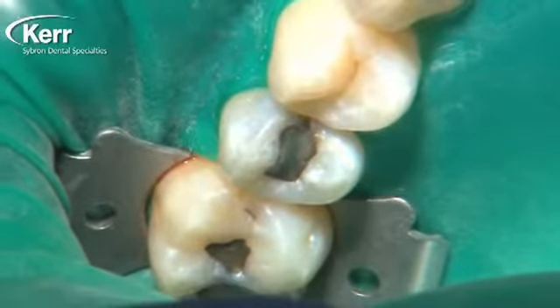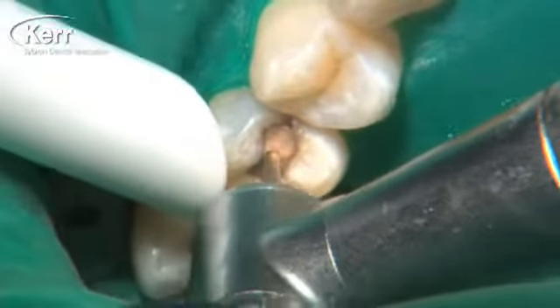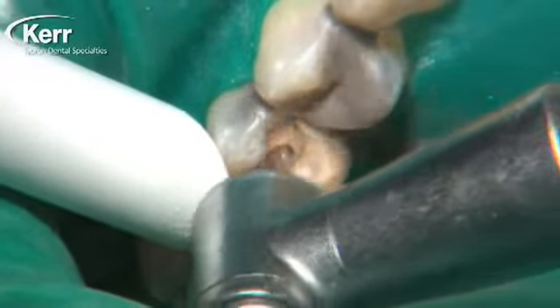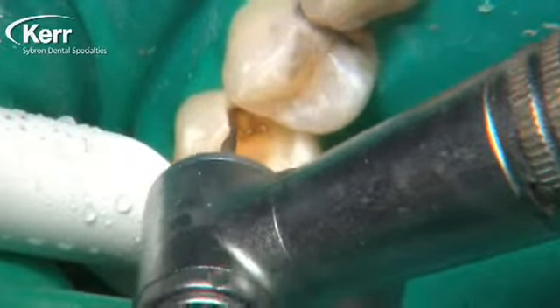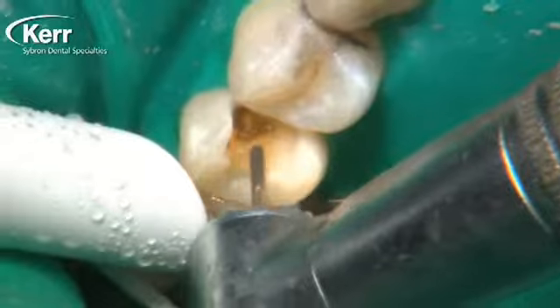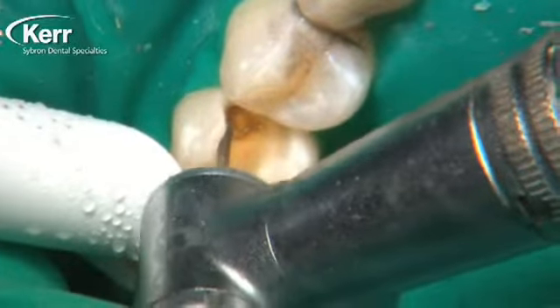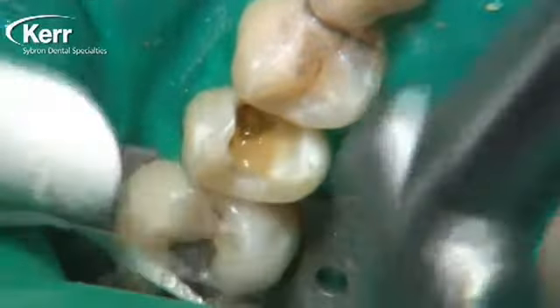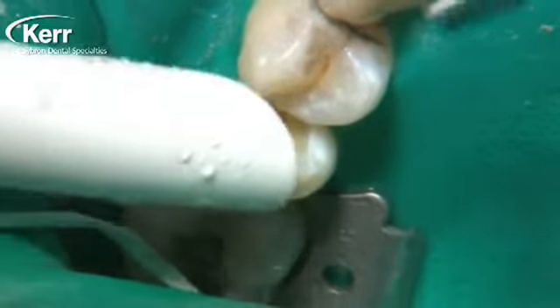One of the great uses for Vertice Flow is as a liner under direct-place composites. In this first restoration, it's going to be a class two direct composite, and I'm going to use the Vertice Flow as a liner underneath it. It's really become common practice today to use a flowable composite under a direct-place composite restoration. Since it's a self-etching flowable composite, there's no separate etching step or separate bonding agent step needed. Vertice Flow bonds to dentin and cut enamel.